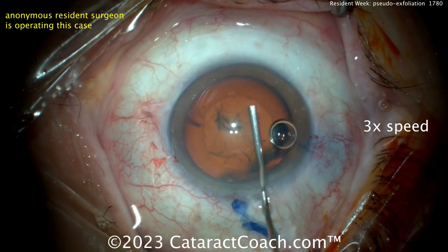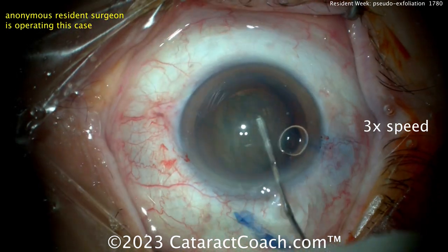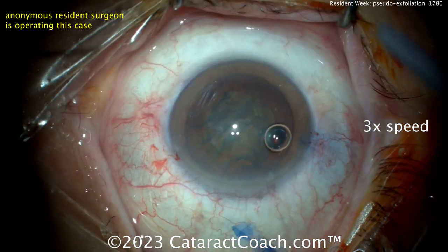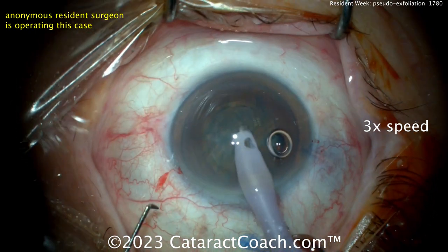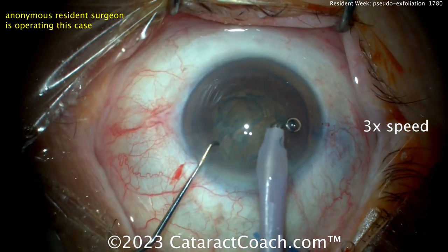Now let's see some hydrodissection — hydrodissection, tapping the nucleus. It looks like there's really good zonular support; I don't see any issues there. There was no wrinkling of the anterior lens capsule. Things look pretty stable. And again, it's good dilation. Though this is a pseudoexfoliation case, luckily it's on the easier part of the spectrum — a good one to cut your teeth on.